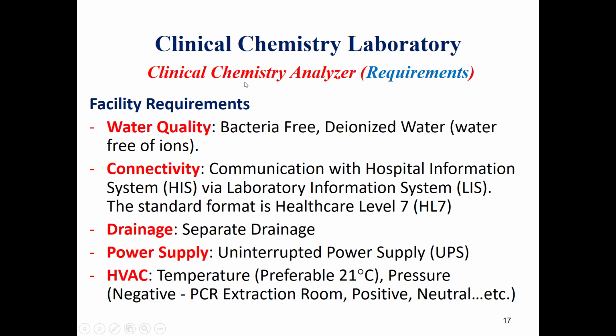Now I will talk about the facility requirements to install a clinical chemistry analyzer and for it to work properly in a laboratory department. The first requirement for the clinical chemistry analyzer will be the water quality. We need deionized water, which is free of bacteria.